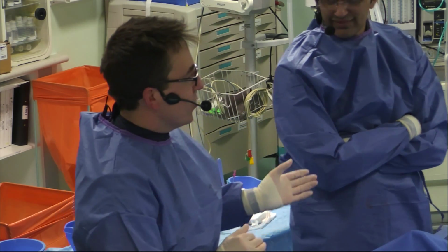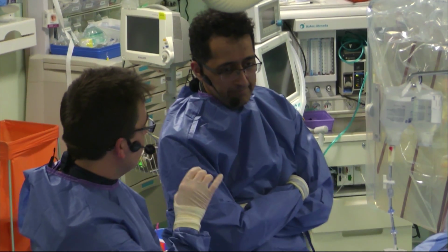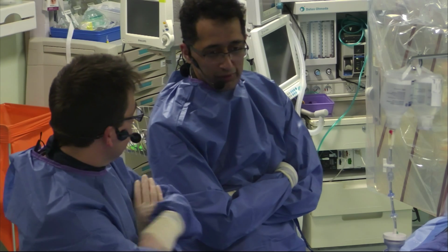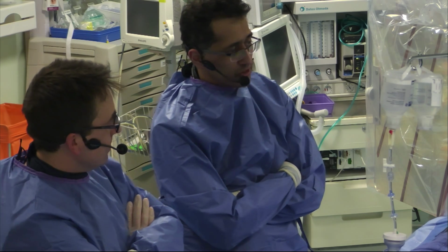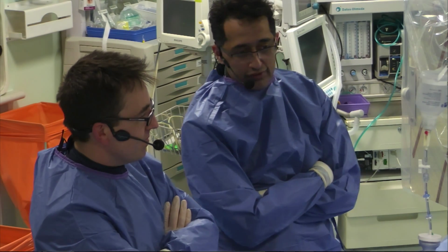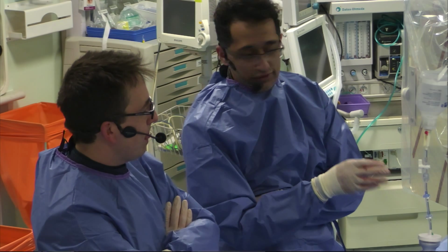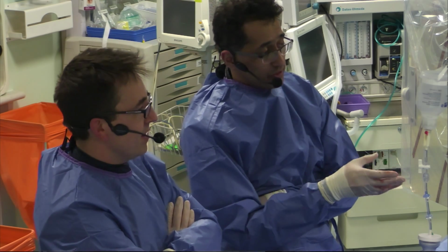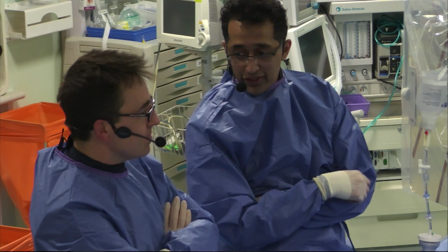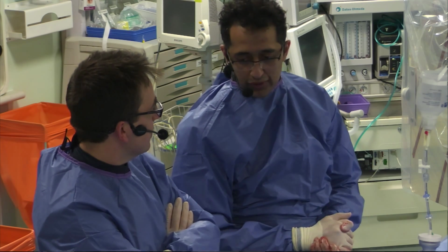Out of the corner of my eye, there's some diffuse disease down the length of that vessel, but essentially the ostium has really no problem. It's wide open. The stent is absolutely beautiful, which shows stenting can work. But the bit that looked very diffusely diseased on IFR looks just as diffusely diseased. There is no focal stenosis. It's not as calcified as I might have imagined in a renal patient, but I think everything fits together with the idea that this is a vessel we should probably be leaving alone.